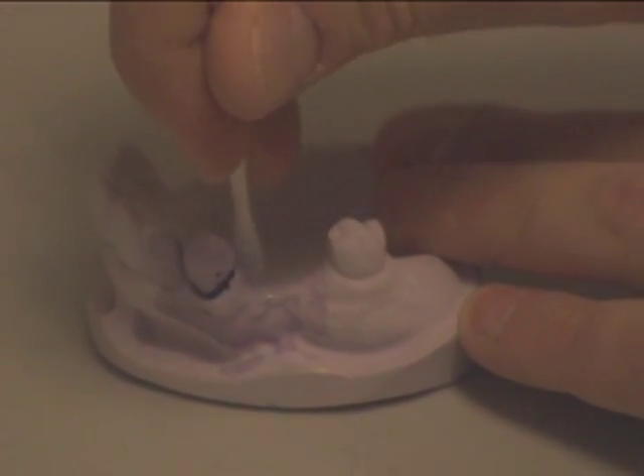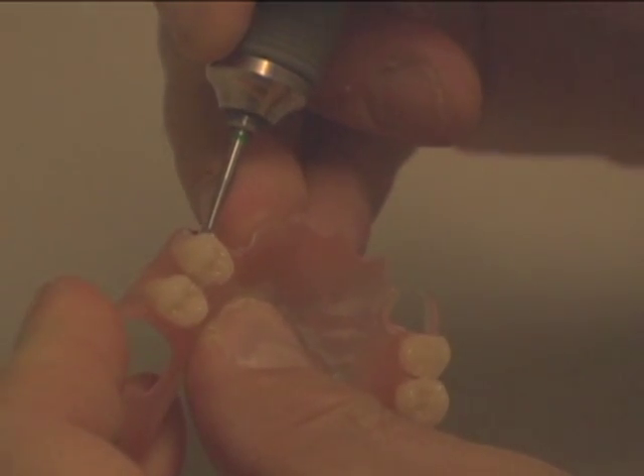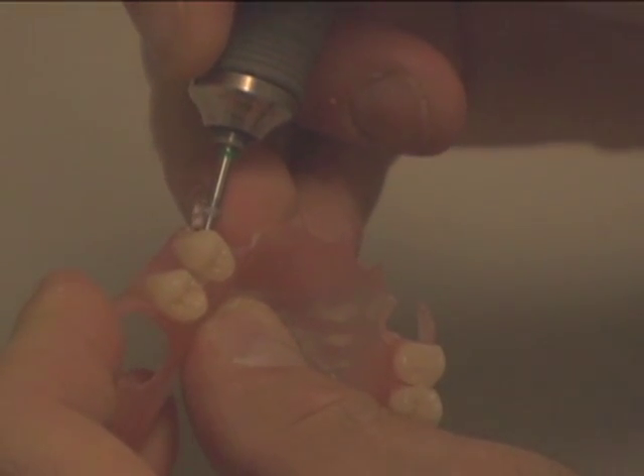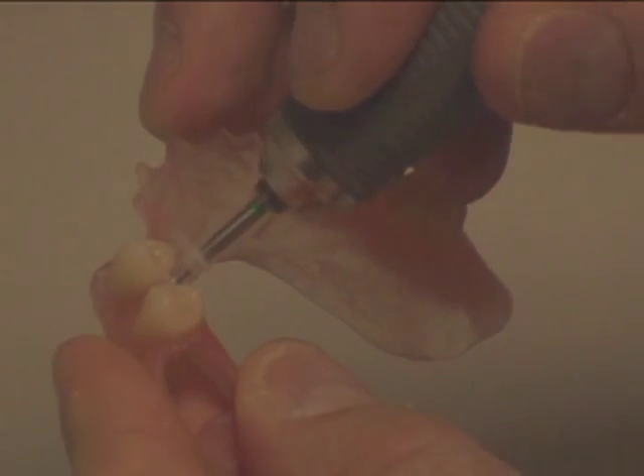After the separator dries, place the partial on the model. Mark the partial with a dot to where a hole will need to be drilled for the material to flow through, creating mechanical retention.